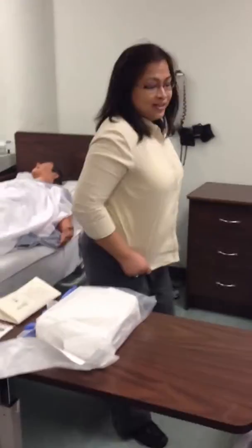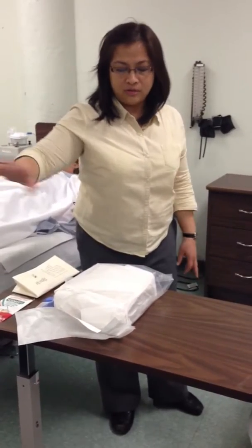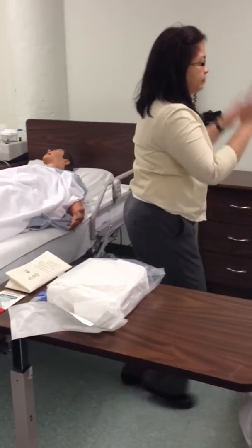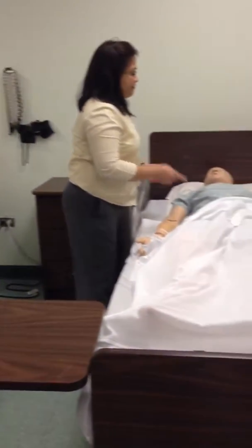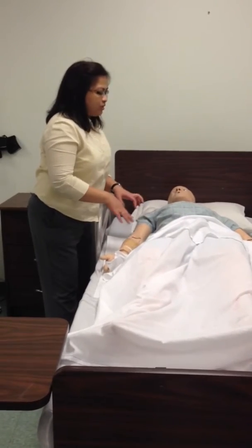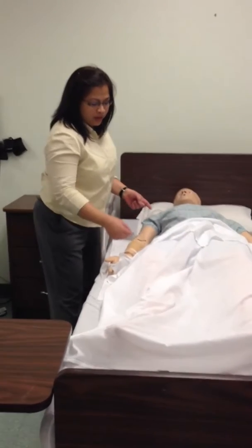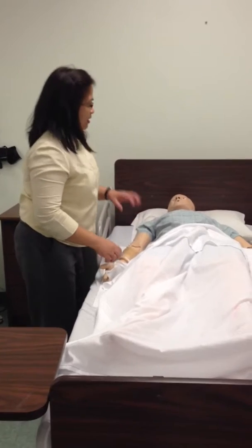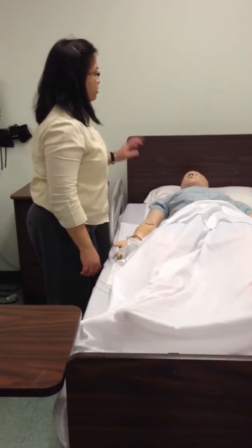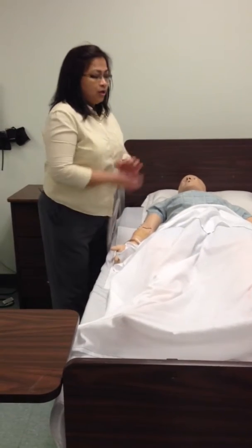All right. So you need to gather the right supplies. It will all be on the table, and make sure you gather all the things that you need. So you go into the patient's room, introduce yourself. Hi, hello, I'm so-and-so from LaGuardia Community College. What is your name? What is your date of birth? Check the ID band, and you explain to the patient what you're going to do. I'm going to insert a Foley on you, okay?